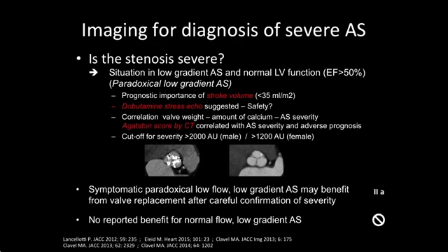However, just as for patients with systolic dysfunction, it is crucial to distinguish severe from pseudo-severe stenosis in this setting of low-flow state. To make this distinction, dobutamine stress echocardiography has been proposed, but the safety of an inotropic stimulation of a small hyperdynamic left ventricle has still to be documented.